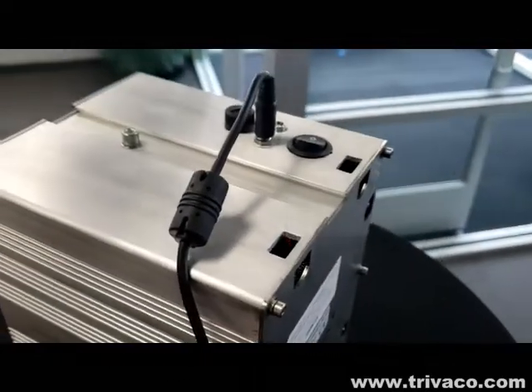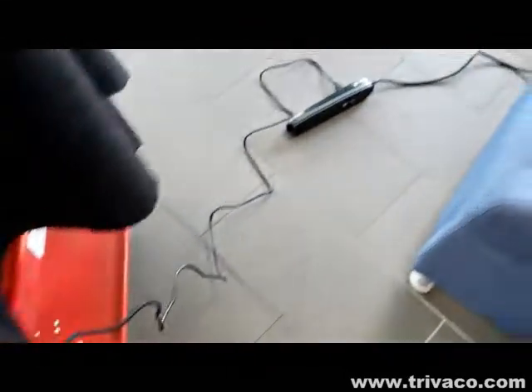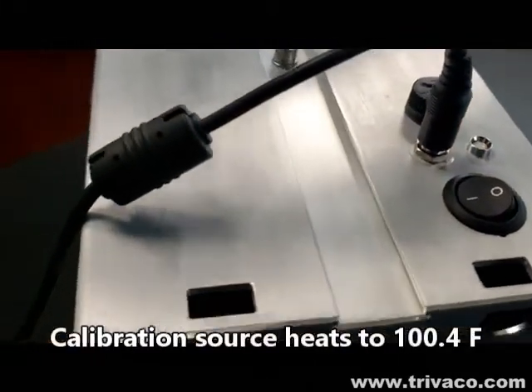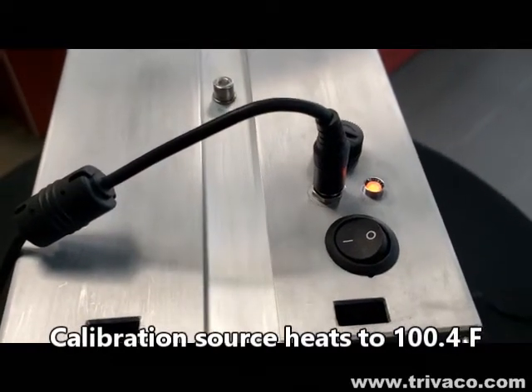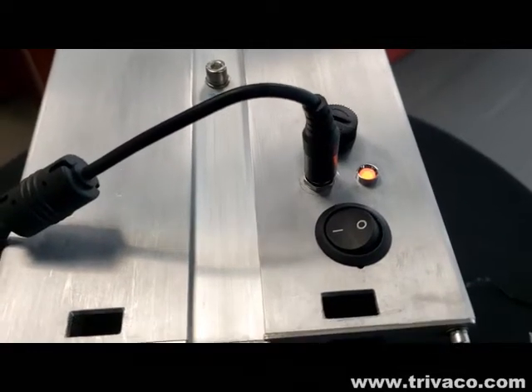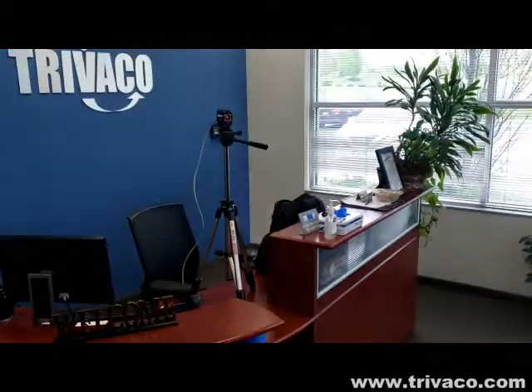One of the first things we've done is connect the calibration source to the 12-volt adapter and into a power strip. We'll turn the power on — the system will power up and heat itself to a steady 100.4 degrees Fahrenheit. Once the LED turns green, we know we're good to go.